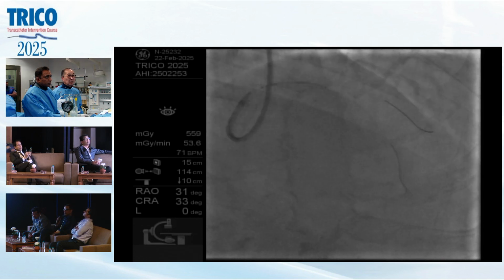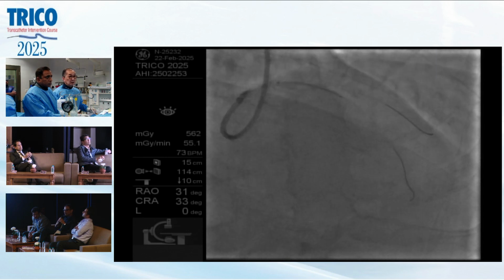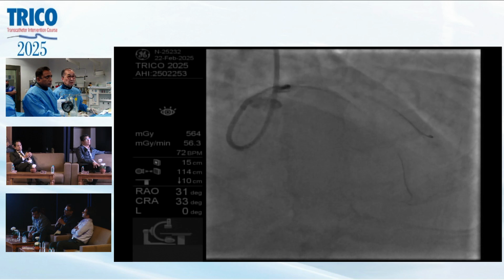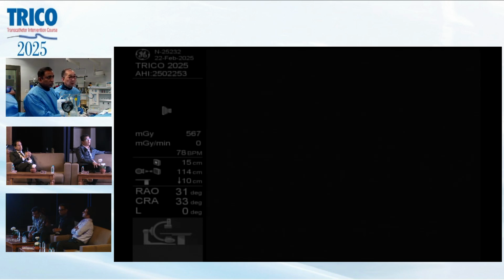So I think the laser cut stents are slightly better for side branch access as compared to the others. But as he said, all the stents are pretty good now for side branch access. Not much difference between one or the other.